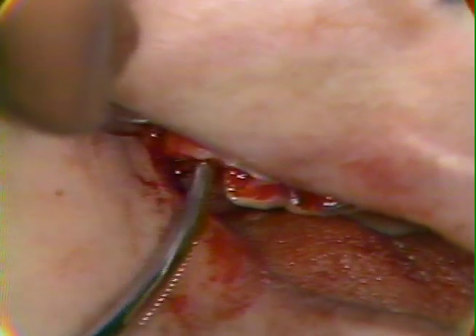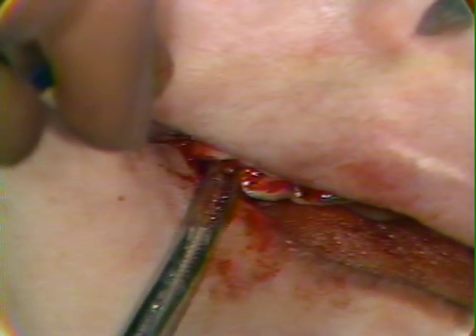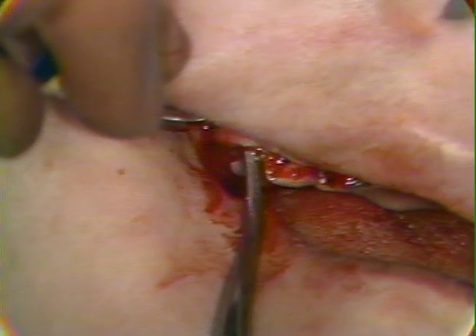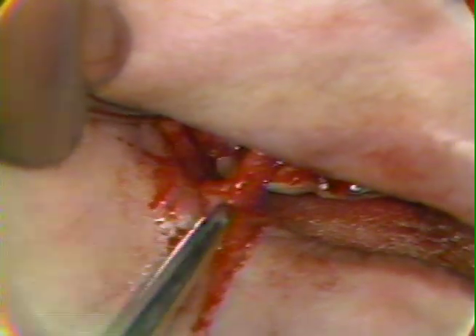The mesial buccal has a little bit of a resistance to it that's increasing really more than that little hemostat can control. So I will go to a root forceps and use that to engage it. That's fine. A little more adequate control with the root forceps, and here we see the mesial buccal root being removed.